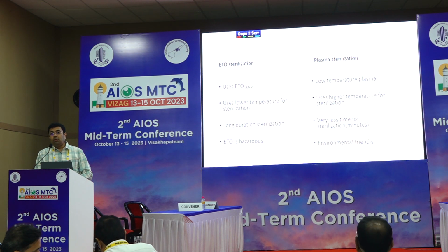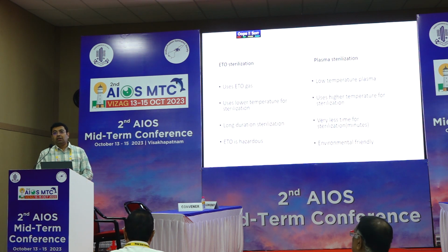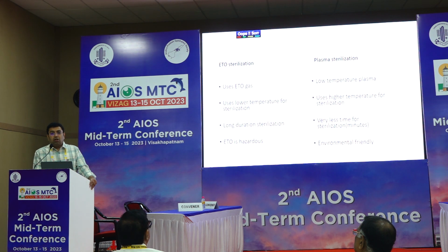And among other disadvantages, ETO is a hazardous, toxic, and cancer-causing gas. So you should always have a proper aeration system in your hospital to see that ETO is properly disposed.